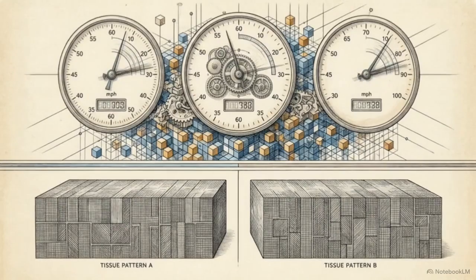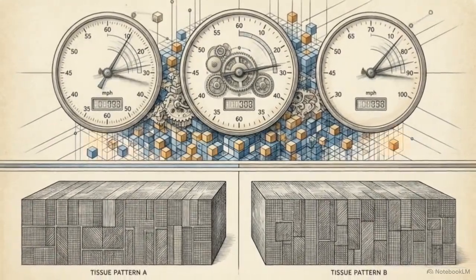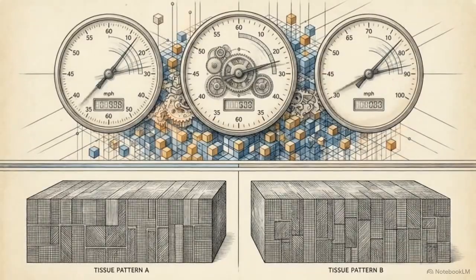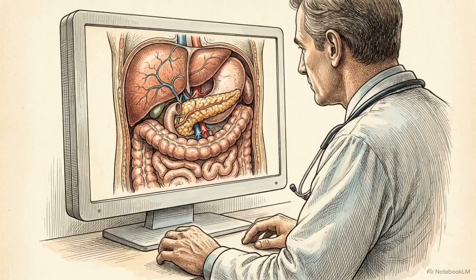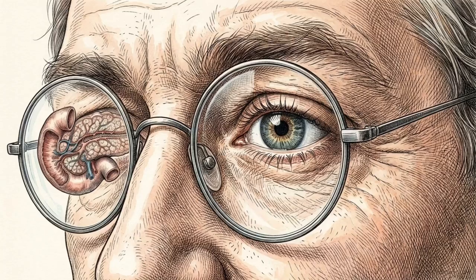Even when the underlying data reveals sharp fluctuations in radiodensity, our biological hardware processes it as a smooth, uniform gradient. To any human observer, the tissue looks perfectly healthy. The earliest biological indicators of a developing cancer exist exclusively within these imperceptible numerical variations, rendering them invisible to human doctors regardless of their diagnostic expertise.